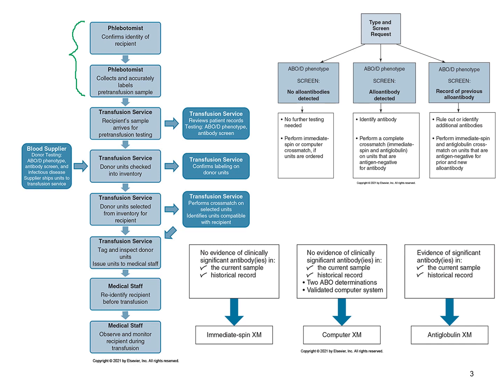So they'll put those on there, which is just an extra identification number that is going to be the identification for that pre-transfusion tube. So that tube that was collected for this particular patient at this particular time is going to get its own blood bank bracelet, and they're usually colored by some means, red, yellow, green. I've seen a variety of colors for these blood bank bracelets, so it's just whatever the facility chooses to use.